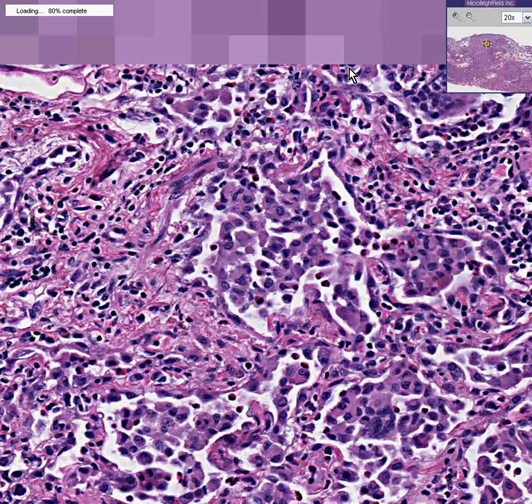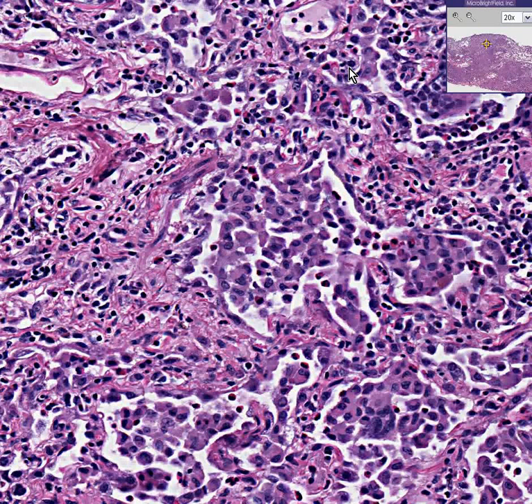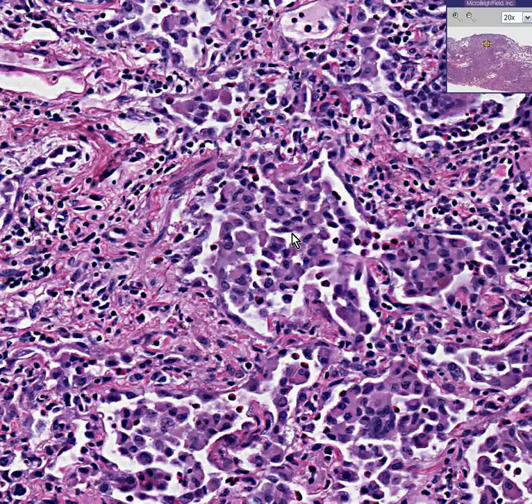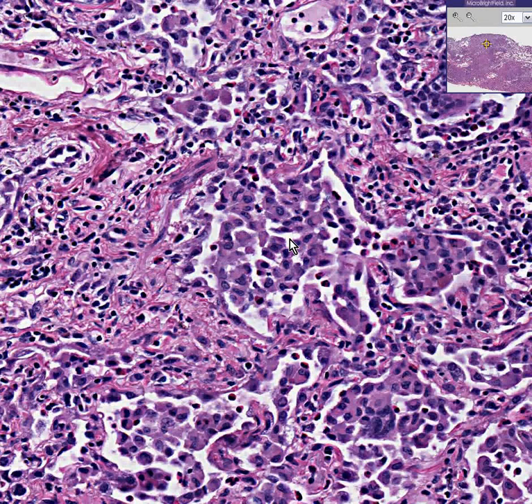This is desquamative interstitial pneumonia, in which the interstitium or septum desquamates its macrophages. It is a very poorly understood disease — nobody has been able to figure it out. It's associated with many things, and think of this as more of a process rather than a specific disease: a process by which the alveolus is desquamating macrophages into itself, seen in many different conditions. Thank you very much.